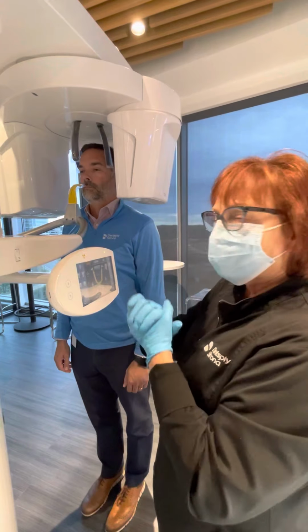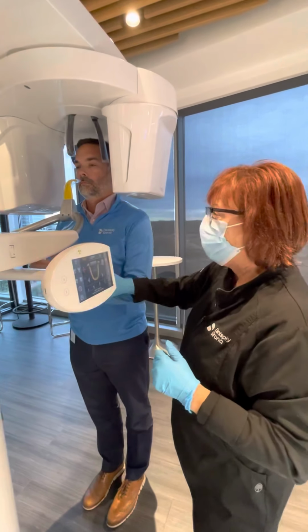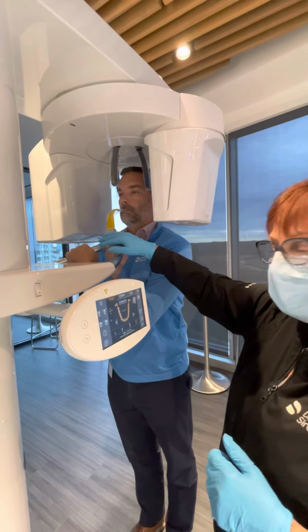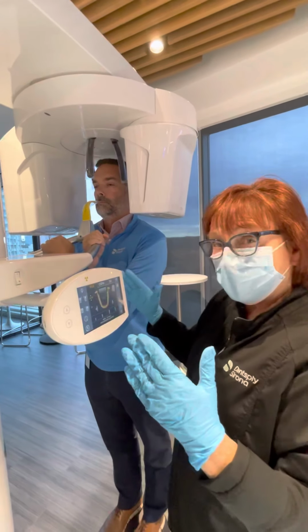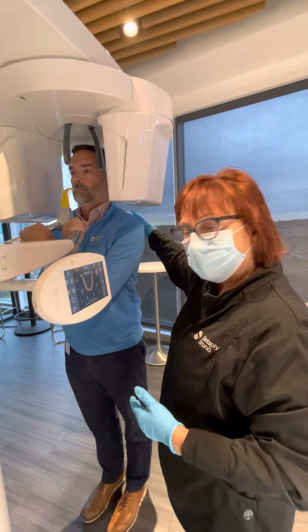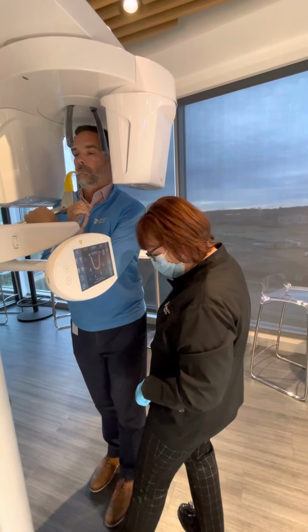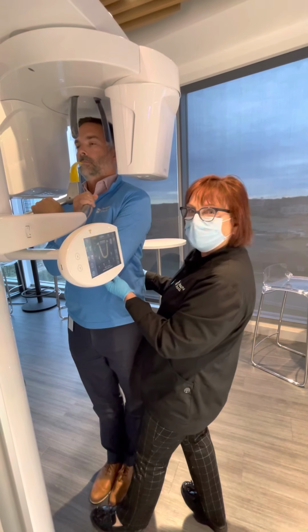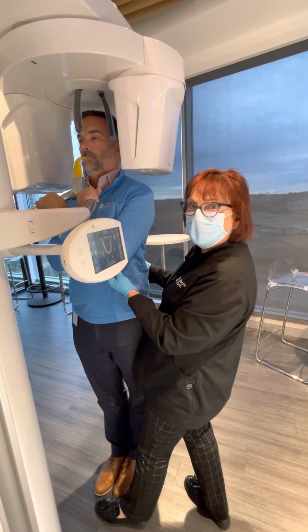So step 1 is we're going to do grab. I'm going to have him grab and crisscross his hands onto the handles. The next step is we're going to talk about the step. Make sure they are standing as tall as possible. And I'm going to place my foot about 3 to 4 inches and have him walk up. And that creates the lean that we need in imaging.